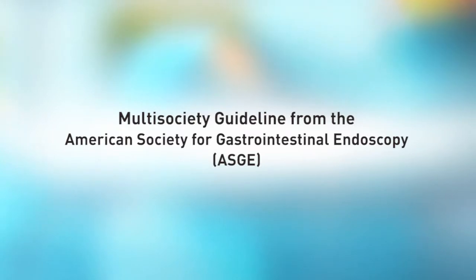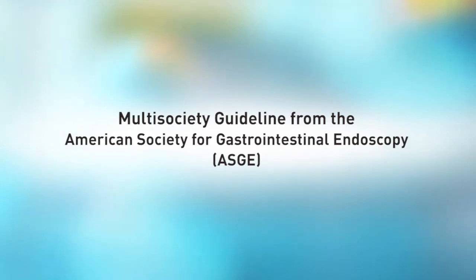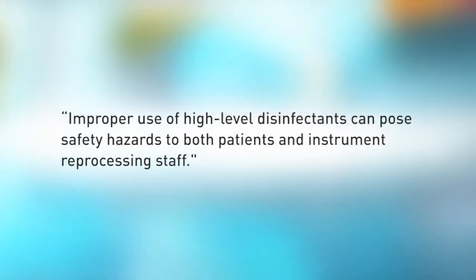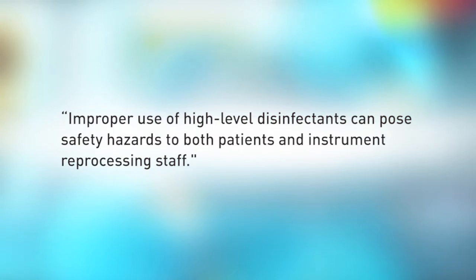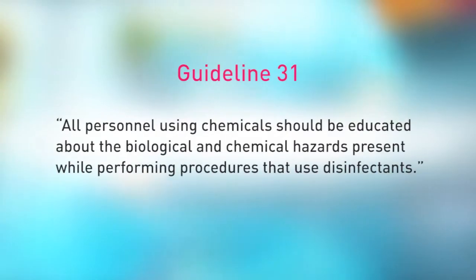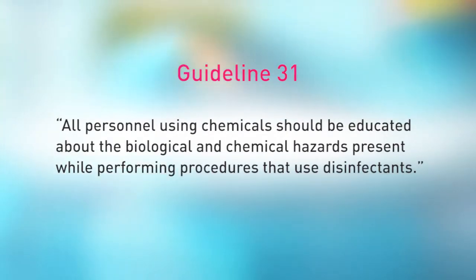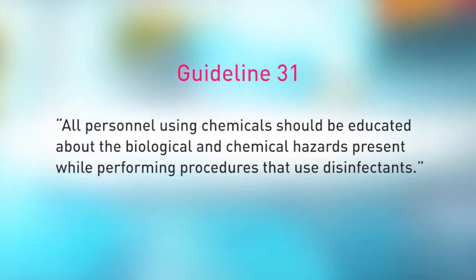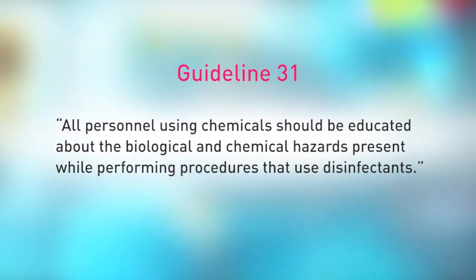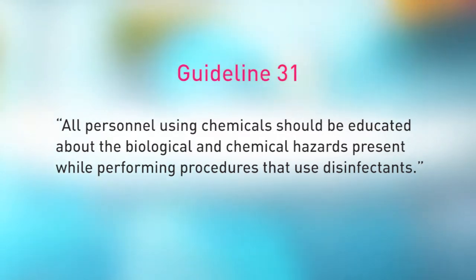First, let's look at the multi-society guideline from the American Society for Gastrointestinal Endoscopy. It states, improper use of high-level disinfectants can pose safety hazards to both patients and instrument reprocessing staff. In addition, Guideline 31 says, all personnel using chemicals should be educated about the biological and chemical hazards present while performing procedures that use disinfectants.